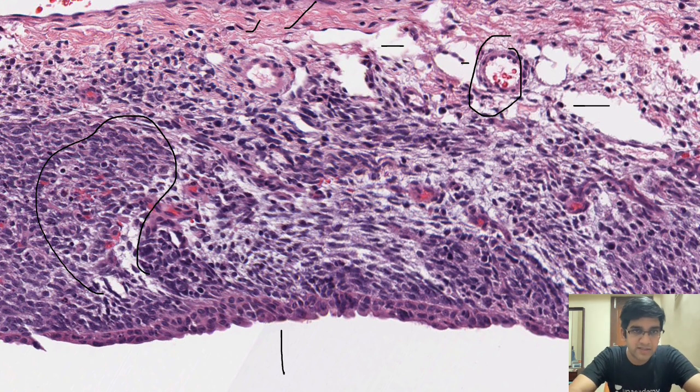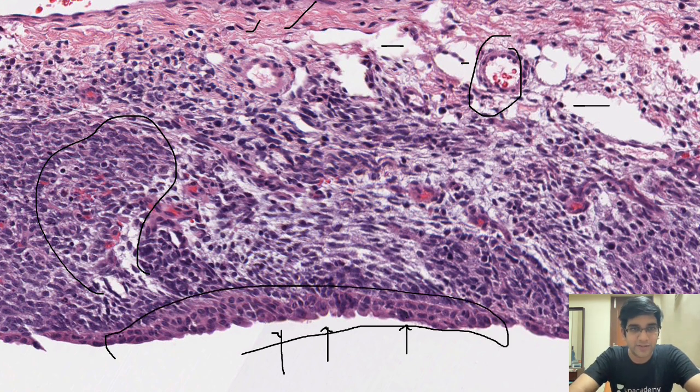And if you notice this, I think you can guess the organ involved. You can see the lining here, right? The lining is a flat lining. This is actually the mesothelial lining, right? I can see the mesothelial lining here, so it should not be a lung mass to be specific. It should have been a pleural mass, right? So now my diagnosis is almost straightforward, but still we'll go ahead and look at the other images.